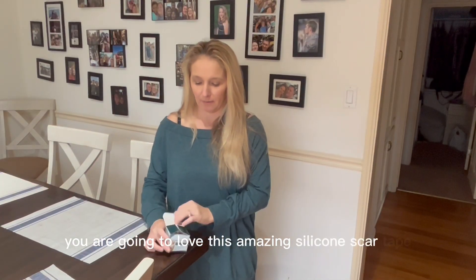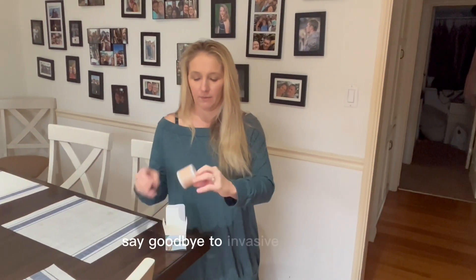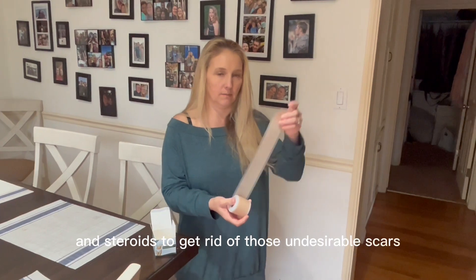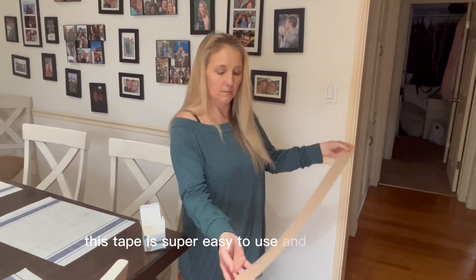Hi everyone! You are going to love this amazing silicone scar tape. Say goodbye to invasive treatments and steroids to get rid of those undesirable scars. This tape is super easy to use and non-invasive.